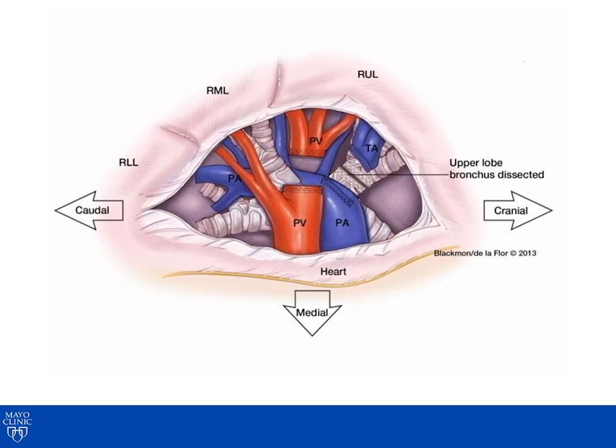the right upper lobe bronchus or the posterior ascending pulmonary artery. These structures are typically right next to each other. By encircling, stapling, and dividing, the next structure that is easily passed around may allow you to either divide the right upper lobe bronchus or the posterior ascending pulmonary artery.